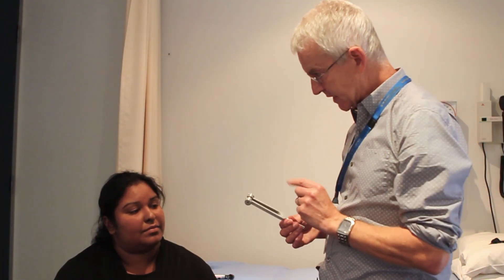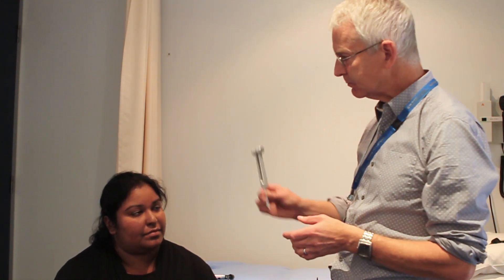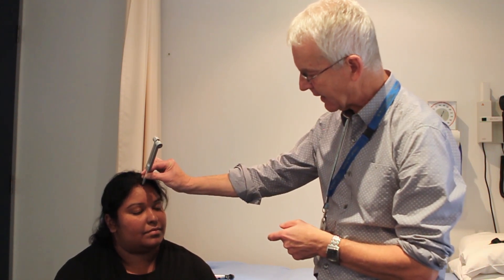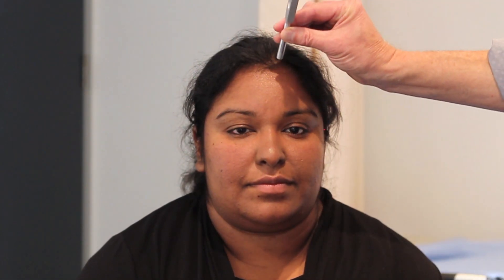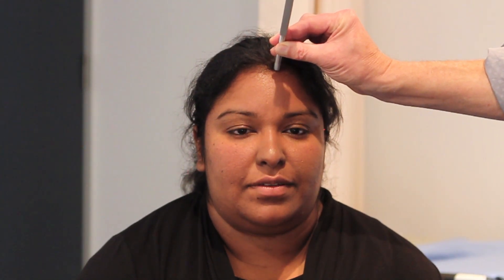Now Naroshi, a further test with the tuning fork is the Weber test. With this, I again activate the vibration and I will then place the tip of the tuning fork just across the front of your forehead and ask you whether you hear the vibration better in one ear or the other. Do you hear that better in the left or the right ear, or is it equal in both? [patient: It's equal in both.] Thank you.